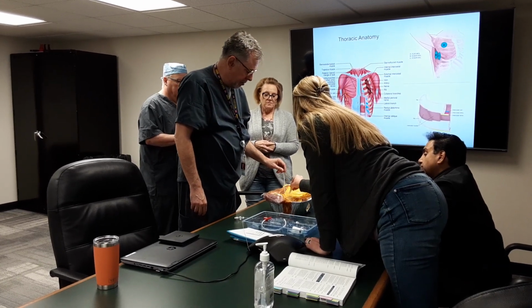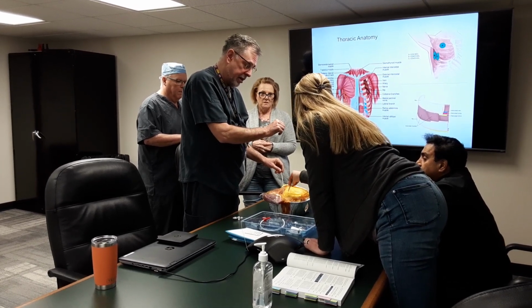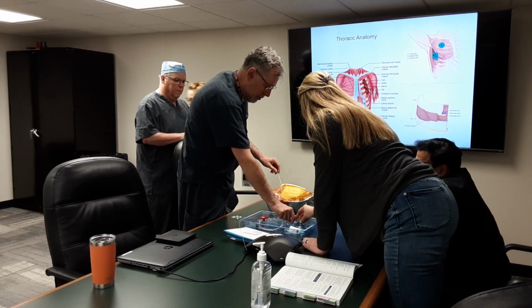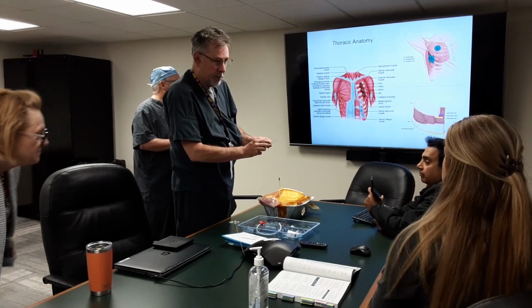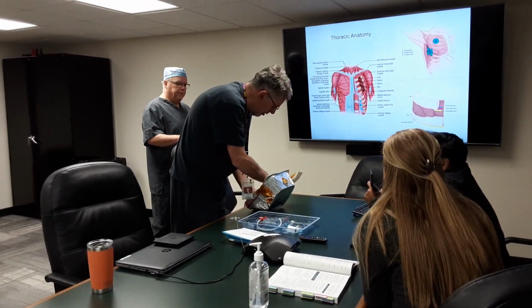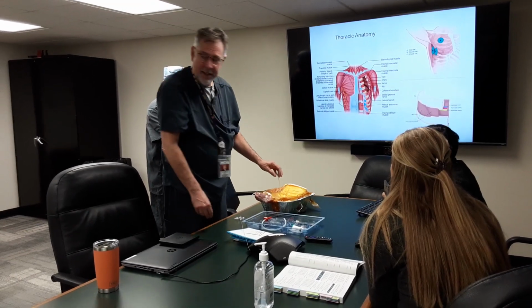What I mean is, when you put this in, I did it right where the wire was, so I want to incorporate where the wire is, and I just push straight in, and I just hopped it. It will not let me get through. So then it's in, I think it's in. It's in. That's like your x-ray, right?